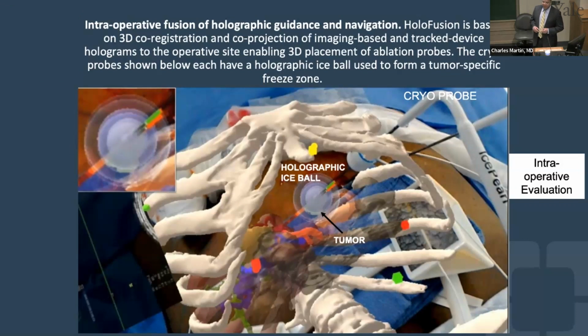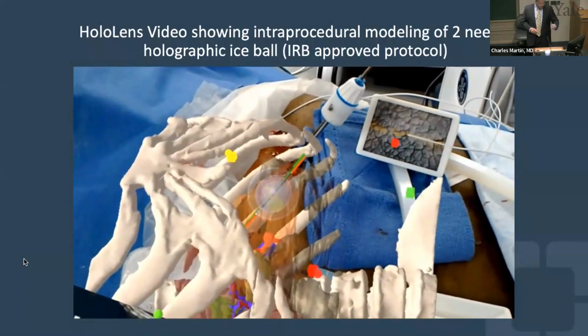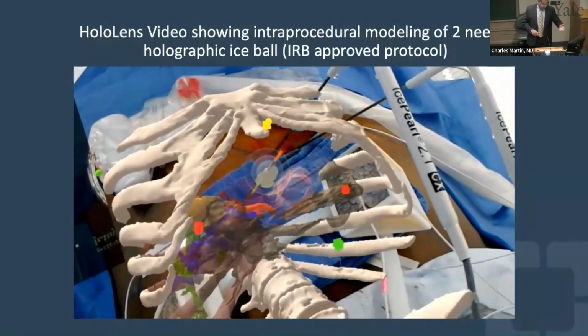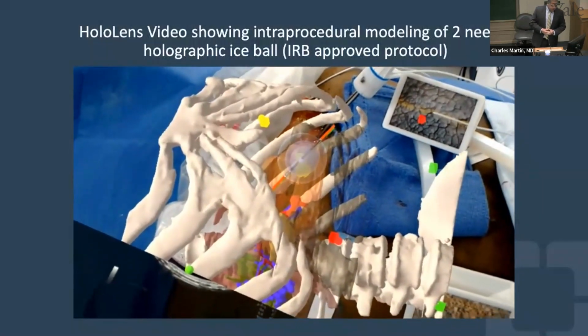I've used this for a lot of my cryo, especially because a lot of times when we're freezing either soft tissue tumors or renal tumors, I'm using multiple probes. So I find it pretty helpful to proceed using our modeling software, just because it'll show me what the kill zone looks like. And you can see it here again. We'll toggle this ice ball right here off and on, and it'll demonstrate where you'll see the tumor once again in yellow, and then you can see how we used it to get to it. And we were quite accurate. We were able to nail this with just 2 probes, an ice pearl and an ice force.